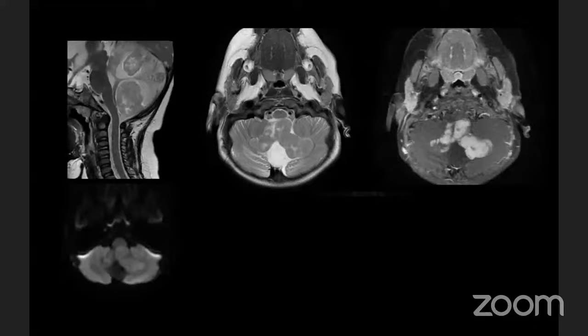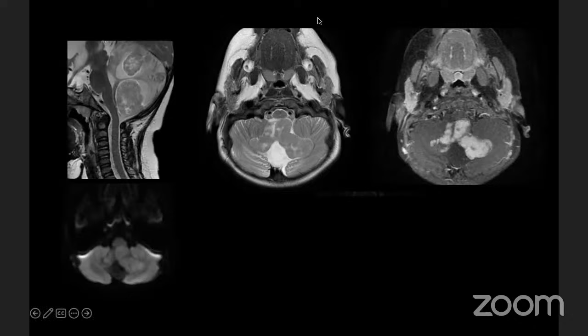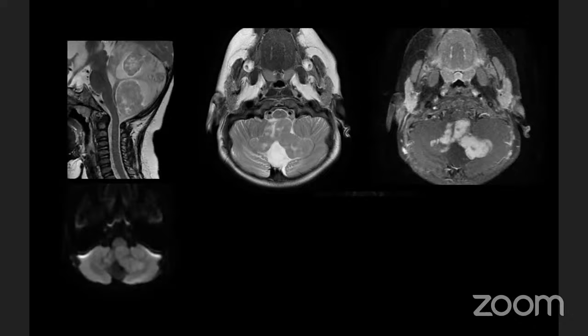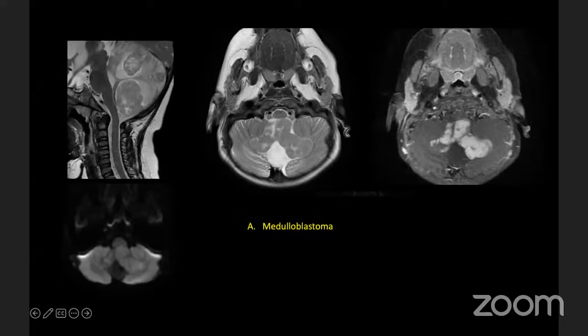Question one: an 11-year-old child with frequent episodes of vomiting. Looking at the MRI — what is the diagnosis? Most participants are answering medulloblastoma. Correct — this is a case of medulloblastoma. The appearance was a little different from what is usually expected, but a midline tumor in a pediatric age group with histopathology confirming medulloblastoma.